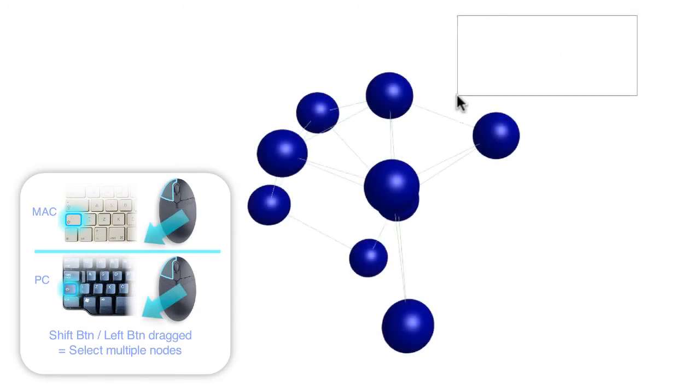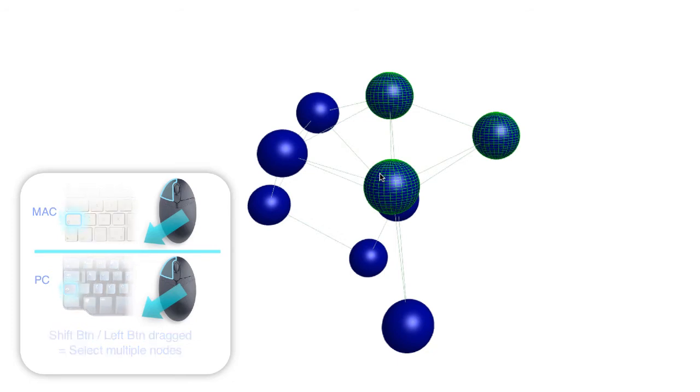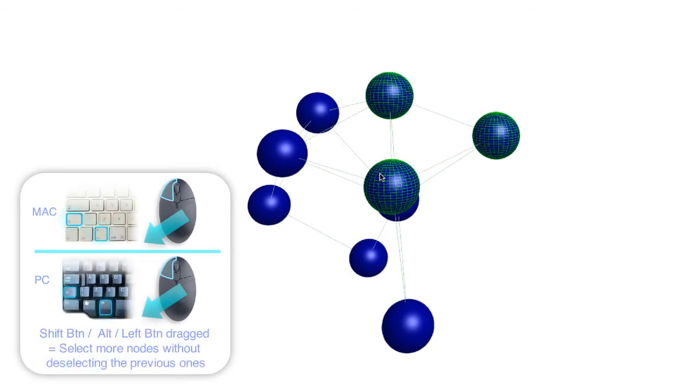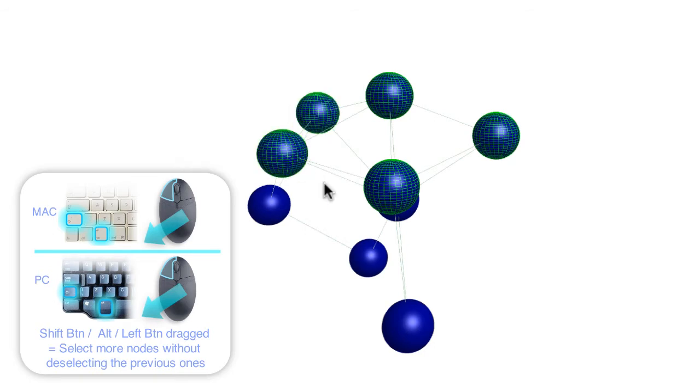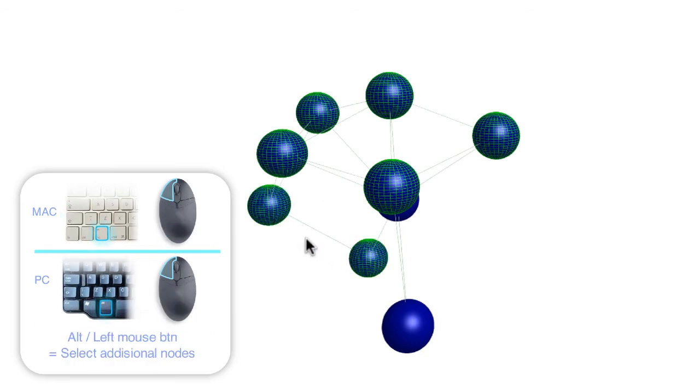Holding down the shift button on the keyboard whilst dragging the mouse with the left button pressed down, you can select multiple nodes. Holding down both the shift and alt keys whilst dragging with the left button pressed down allows you to select more nodes without deselecting the previous ones. In addition, nodes can be selected by pressing the alt button and clicking on additional nodes you wish to select.